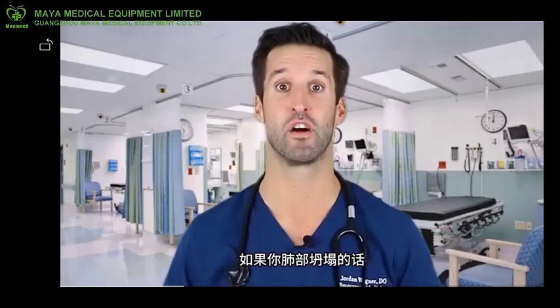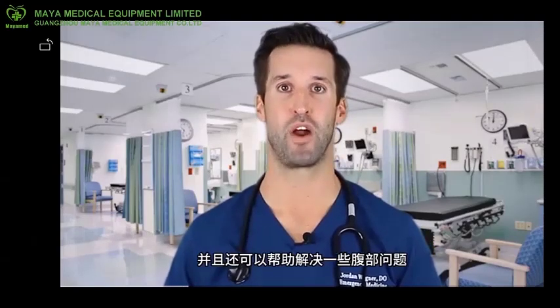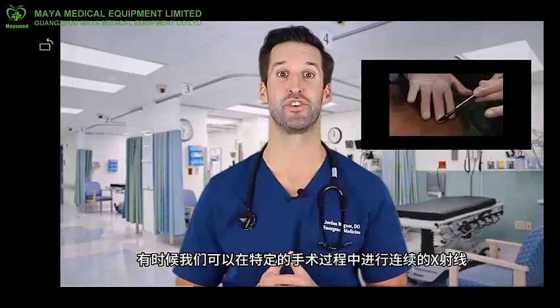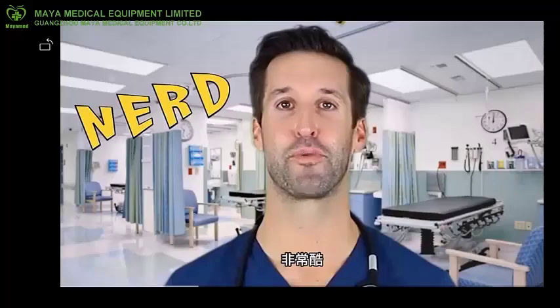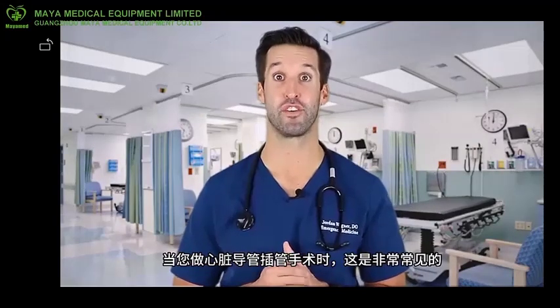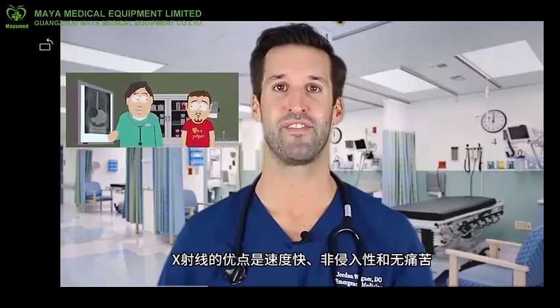If you have a collapsed lung, it could also look for some tumors, and it also will help with some abdominal problems. Sometimes we can do continuous X-rays during specific procedures. That way doctors can see in real time what is happening. Super cool. This is very common when you're having a cardiac catheterization for your heart. The advantages of the X-ray is it's quick, non-invasive, and painless.